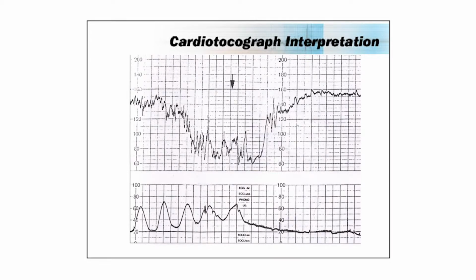It's on the screen. What happened here? Yeah, someone said tachysystole. It is hyperstimulation, but it's not tachysystole. 1, 2, 3, she's only having 5 contractions in 10 minutes. That's not tachysystole. Tachysystole is more than 5 in 10 minutes, but it is hyperstimulation. What's the type of hyperstimulation that it is? I mentioned it earlier this morning. There are 2 types of uterine hyperstimulation. One is tachysystole, and the other is hypertonic.